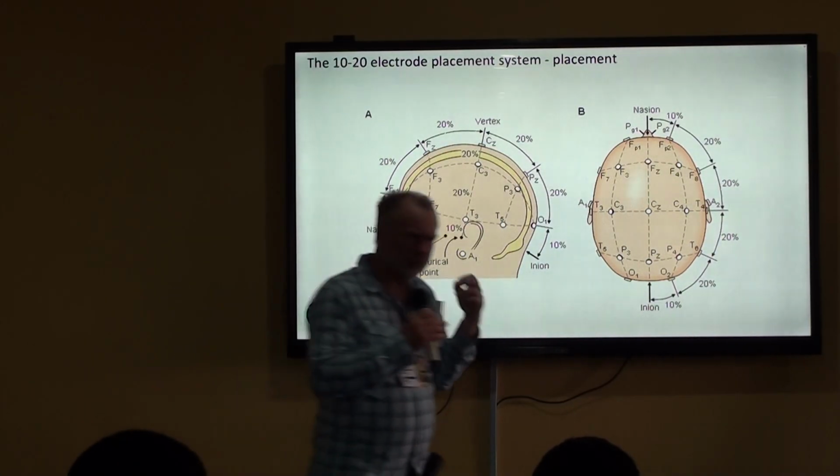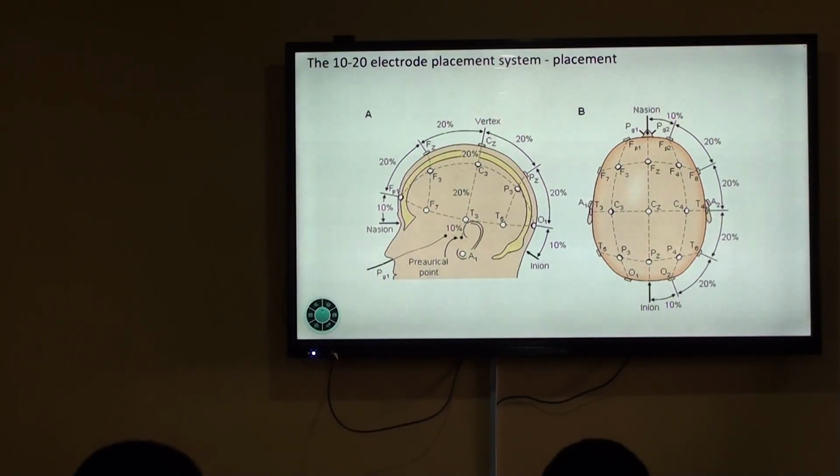And actually what we often would do, if we're preparing this, is use a measuring tape. So let me just get a measuring tape out, if they're still here.